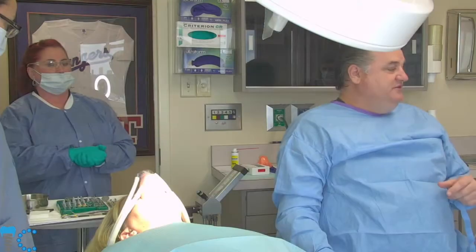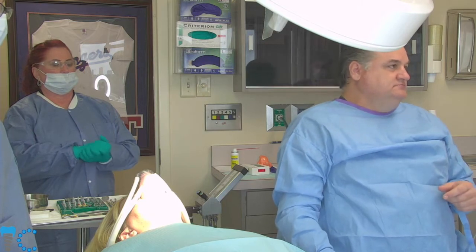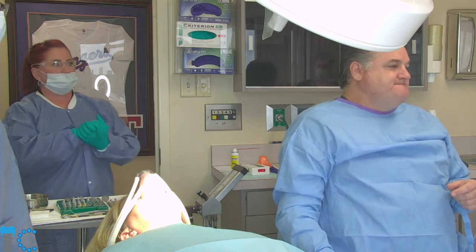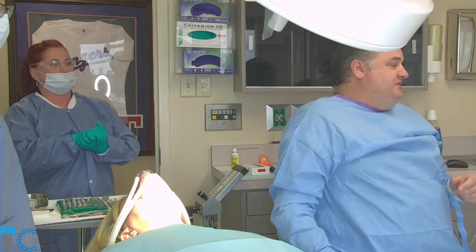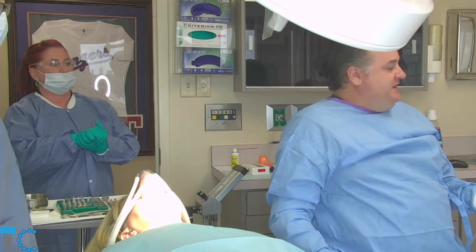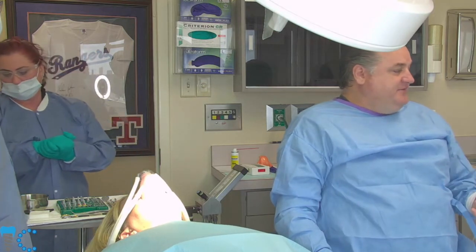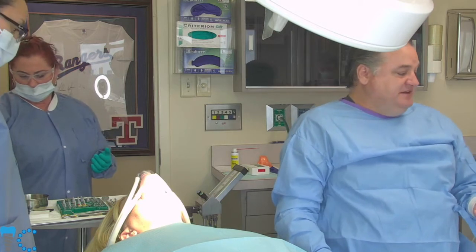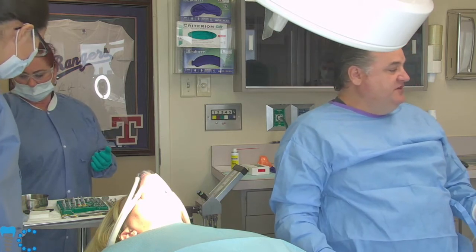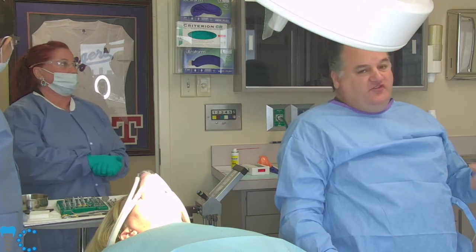A lot more load than any other tooth. So it could be probably something with drilling, or maybe too high speed on the implant motor, or something like that. I would say that after the time of surgery, the reasons for failure are when the patient has the opportunity to function on it and is eating hard foods on it, or the other big thing that we see is over-torquing the implant.